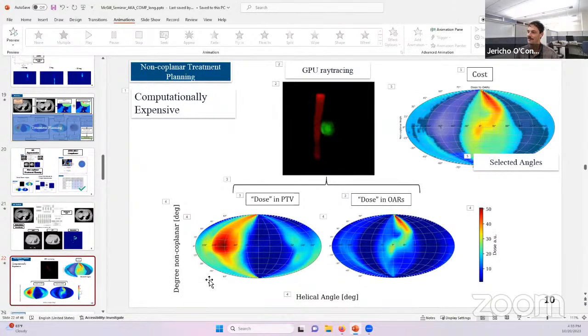So to start, I just use GPU ray tracing through the Tigre. It's French, so you have to say Tigre. I would want to say Tiger. Python package, and so it's all analytical to start. And from that, I just get the attenuation estimate. I used to do a lot of CT, so it's more of an imaging sort of thing, but you just get the attenuation in your different structures that are segmented from the structure set. So I get attenuation in these objects.